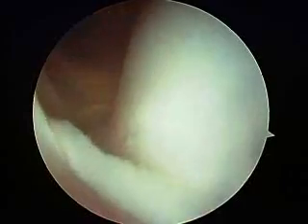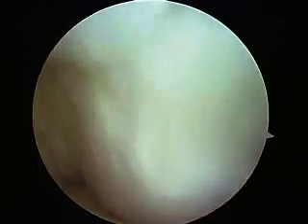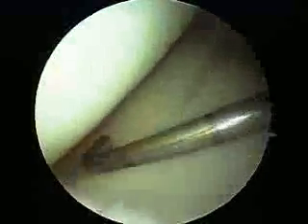That'll come out. Now we're going to go look in the lateral. This is the outer side of your knee. This is called the lateral gutter. And again, that is totally normal. There's no loose bodies or anything in there. And it'll come around. You'll start seeing the lateral femoral condyle again right there, and the lateral meniscus right there. This is the lateral face of the lateral femoral condyle. This is the periphery of the lateral meniscus. See it? And we can open that up again and show you the joint. Slight figure 4. Put it in slight figure 4. There. See, there's your lateral compartment again.